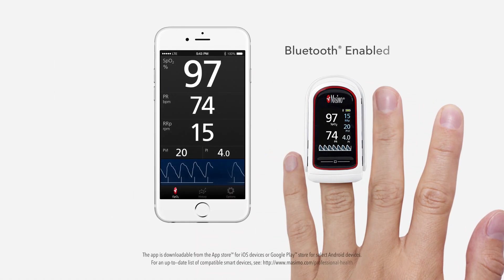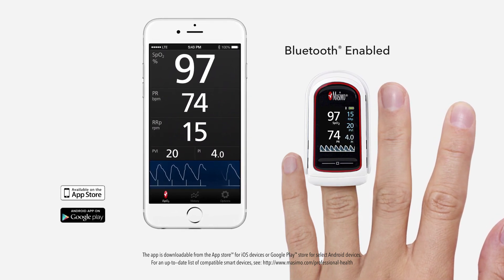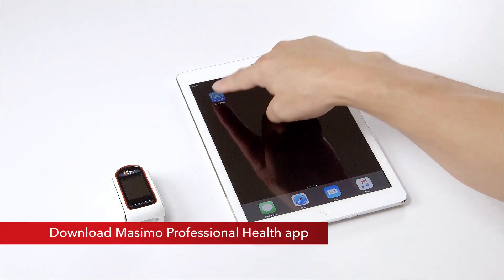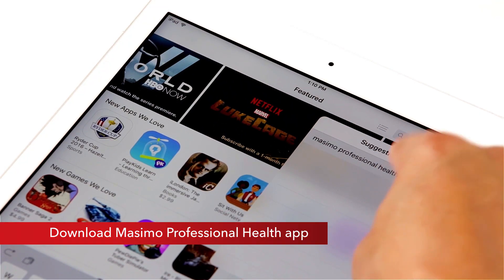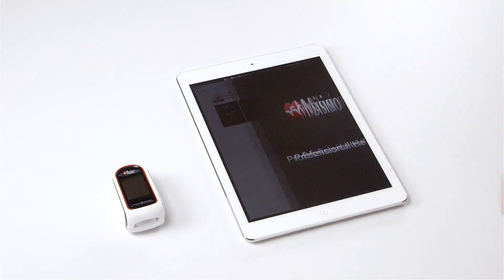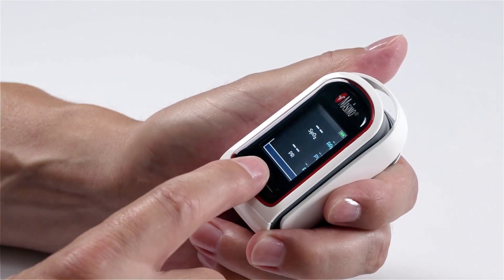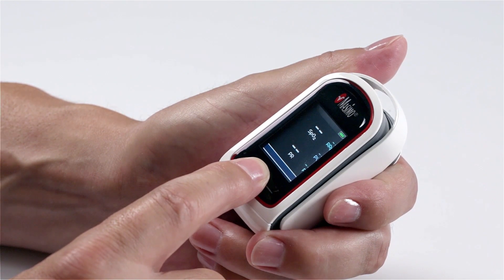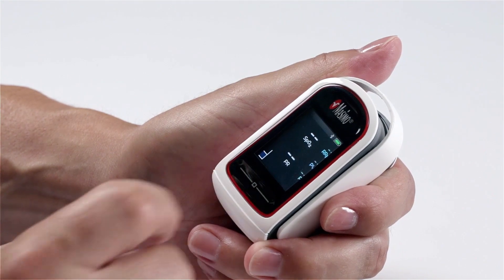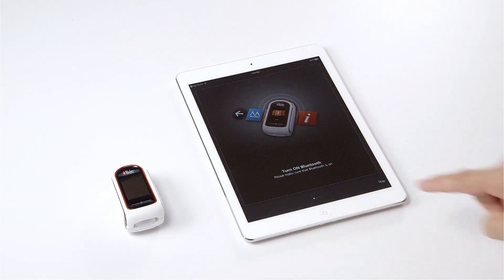To use the MidiSat RX with your compatible smart device, do one of the following: for Android powered devices, go to the Google Play Store; for Apple devices, go to the App Store. Search and download the Massimo Professional Health app. When the download is complete, launch the app and select MidiSat to connect the MidiSat RX. Turn on Bluetooth on your MidiSat RX pulse oximeter, then ensure Bluetooth is enabled on the smart device, following the app instructions as shown on your smart device.